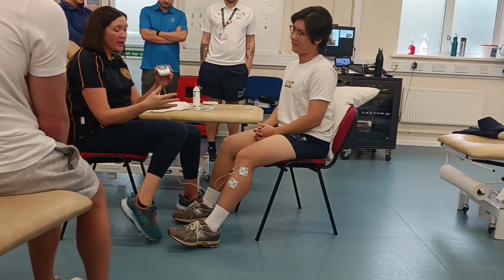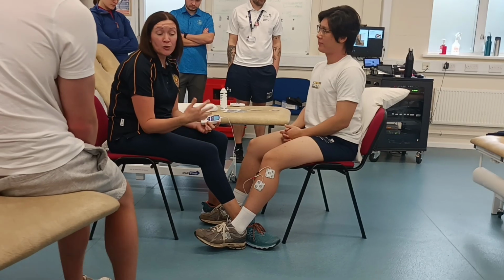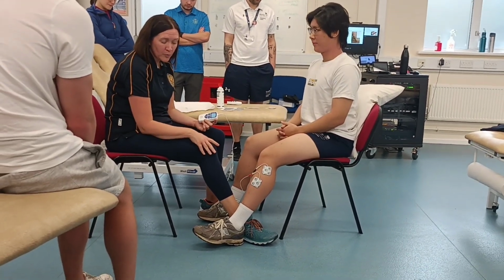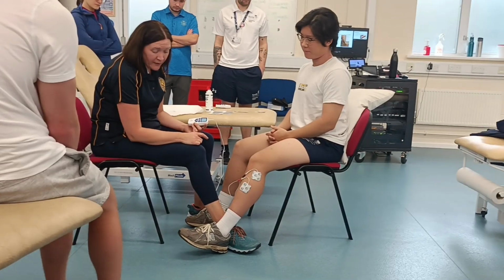Okay, always show my patient what movement I'm looking for, because if they've only got a flicker of dorsiflexion or no dorsiflexion, it's going to be quite a shock that their ankle moves that much. So yeah, that's it really.